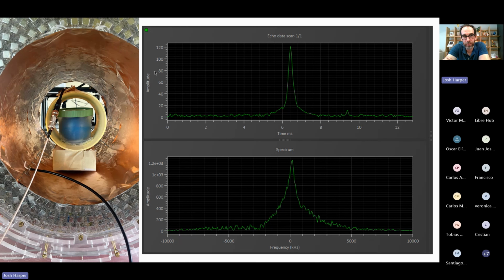So this is quite a nice spin echo. This is an unshimmed magnetic field, so we don't expect the frequency to be quite a tight line like we want it to be in the future. Of course, you can see that I've grounded my shield, which is really important for noise, so I need to ground that to the same ground as my RF ground.